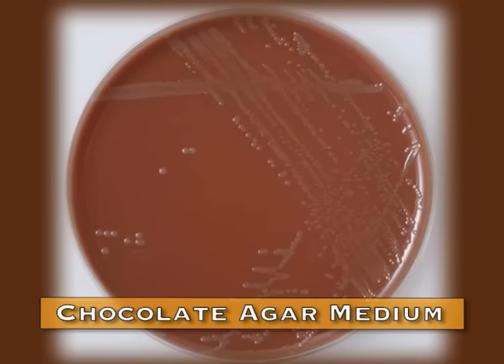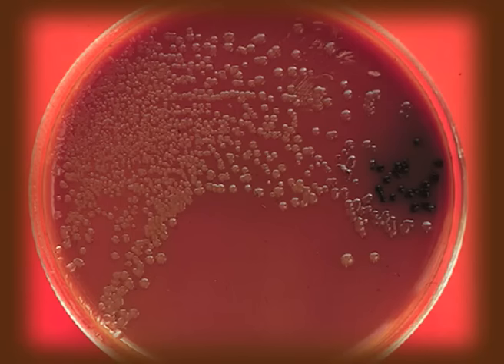We have another example of an enriched medium, that is chocolate agar medium. Chocolate agar medium is produced when the red blood cells are heated and lysed. So what happens? The nutrients present inside the red blood cells are leached into the medium, making it more nutritionally rich, and after heating, the red blood cells lose their integrity, and when added to the medium, it forms a chocolate color. Hence, the medium is known as chocolate medium, since the color is similar to that of chocolate. The organism grown in this chocolate agar medium is Haemophilus influenzae.